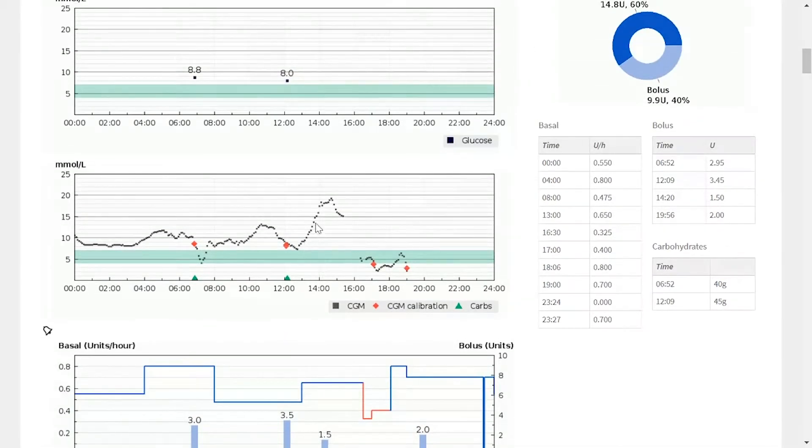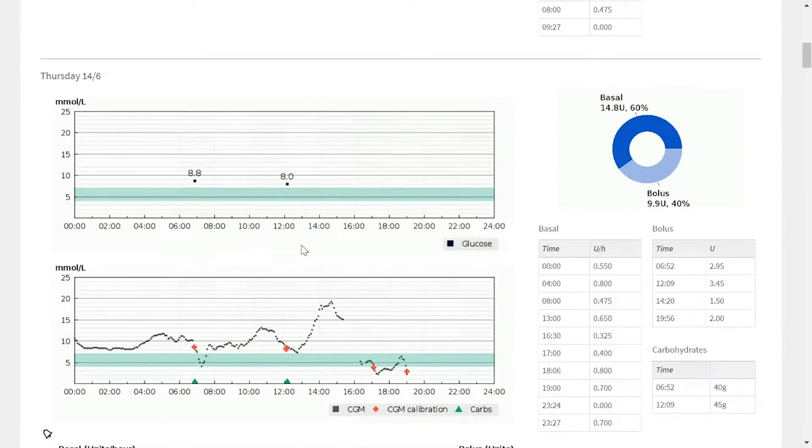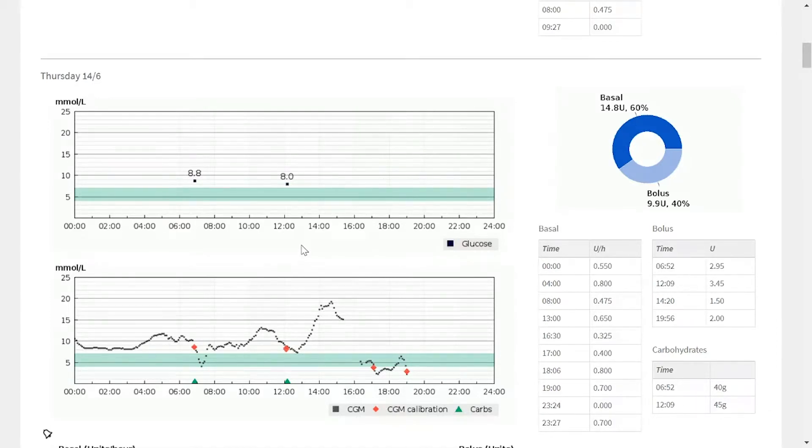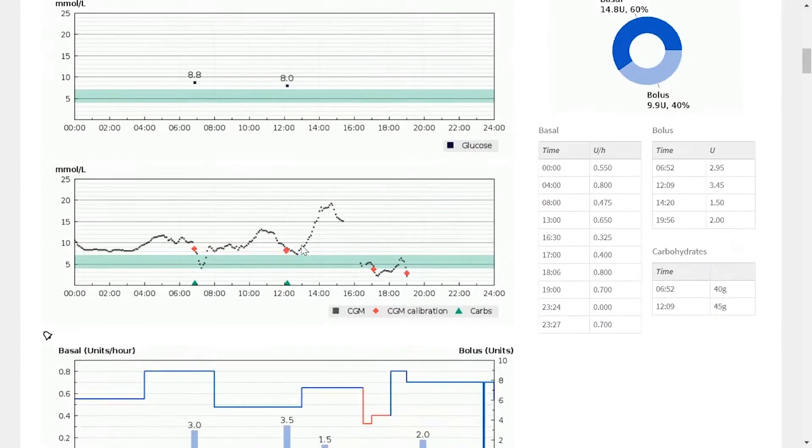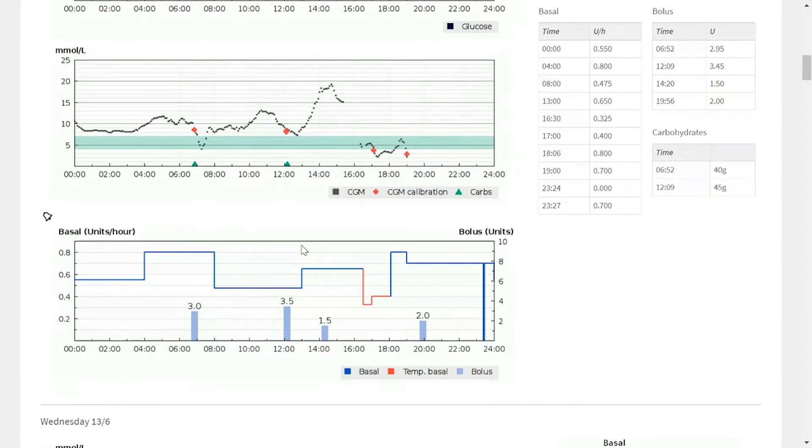This information can actually be used to decide whether a patient is treating certain life events effectively, if any changes need to be made, maybe it's lifestyle discussions, maybe it's actually settings on an insulin pump. There's all manner of different conversation topics that a clinician can have based on this information.